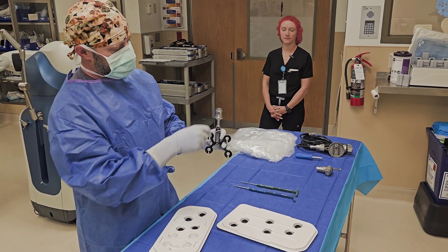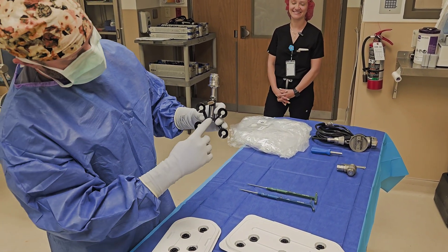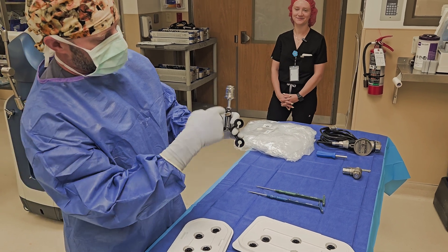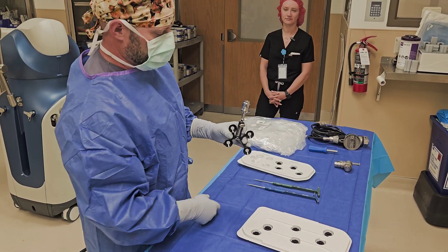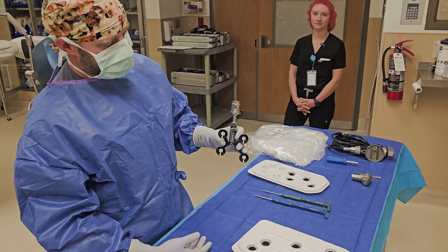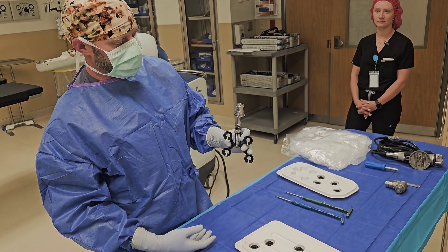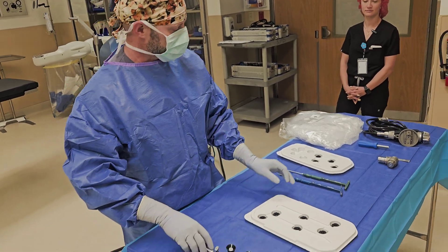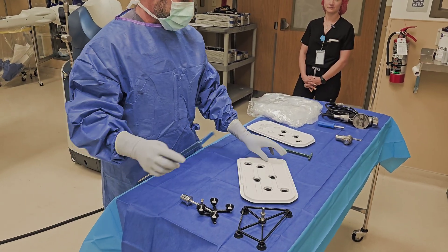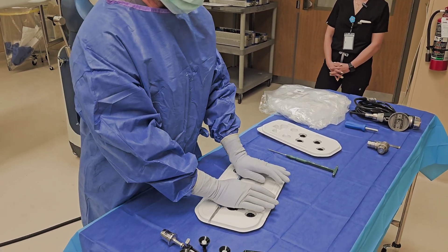Hang the plunger down until metal touches metal, using gravity to assist, and tighten the screw. The screw is important to look for because it can be loose in the tray sometimes — SPD isn't always putting it on there perfectly. There are pictures that match everything up; just keep it simple.